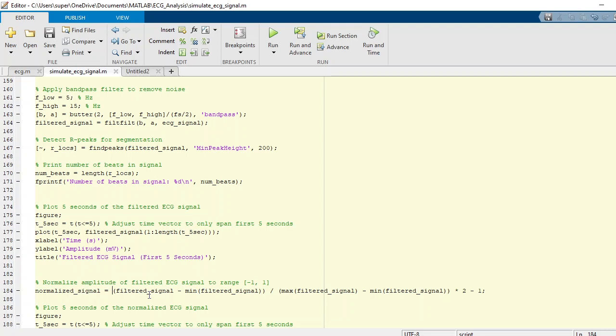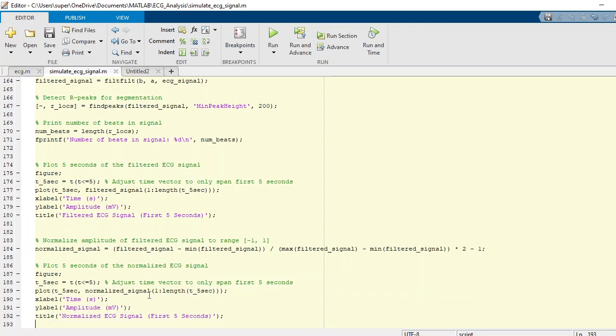That's the basic formula for normalization which we applied to get a range of signals normalized in minus one to one. We can take five seconds. We repeated this five seconds code here, which we don't need. You can apply a global variable with this and you can reuse it throughout.